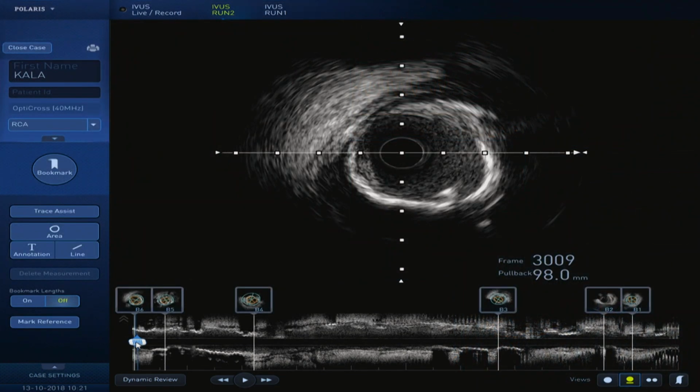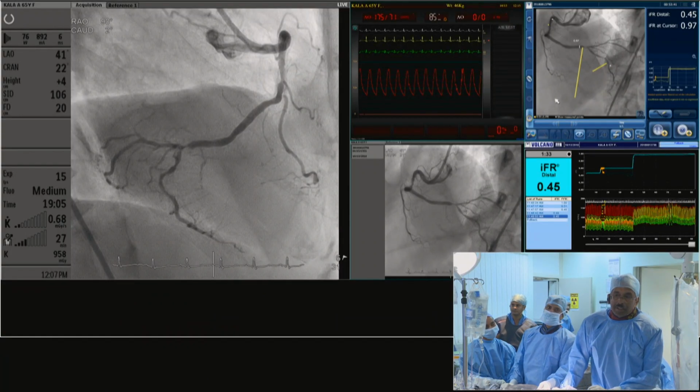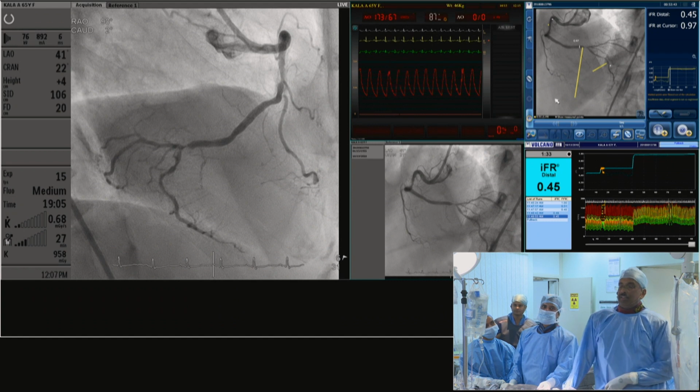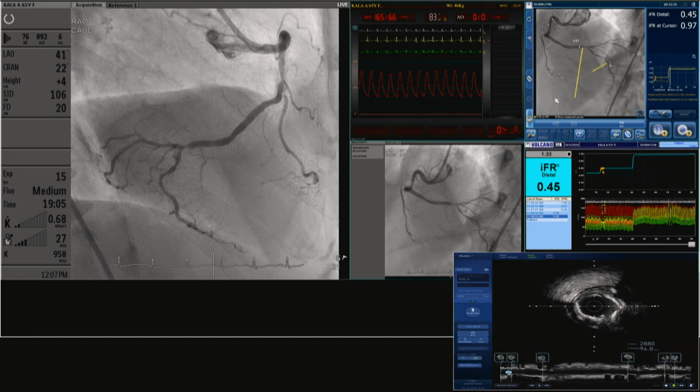Panel, I would actually ask the panel as to what would they want to do with this. Could we have your comments on this, please? Imaging followed by maybe a rotablator if we find significant calcium for the mid RCA. The distal RCA and PDA probably just balloon dilatation in case you find significant lesion, and then the stenting strategy could be starting from the PDA to distal RCA, jail the PLB, and then stent the mid RCA.